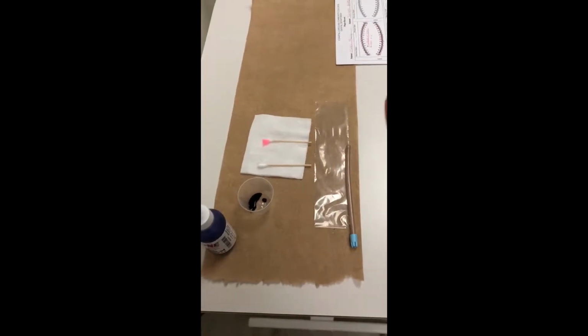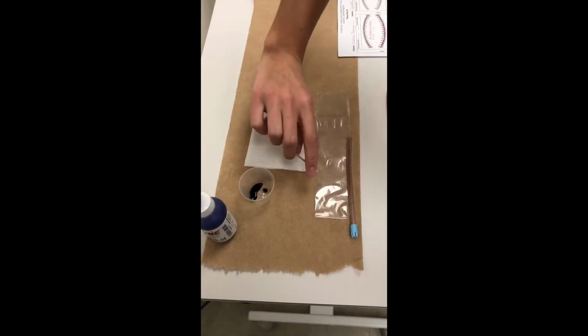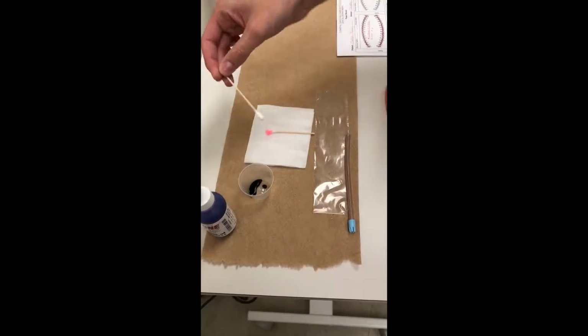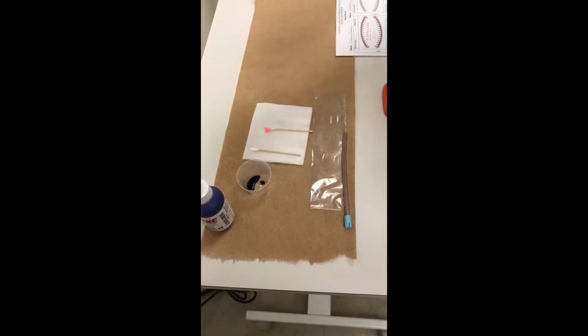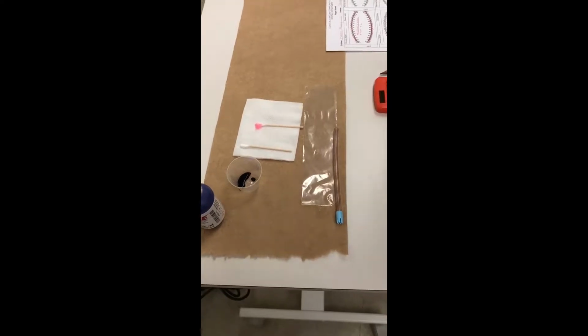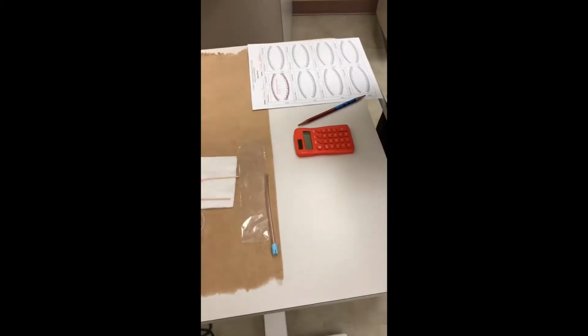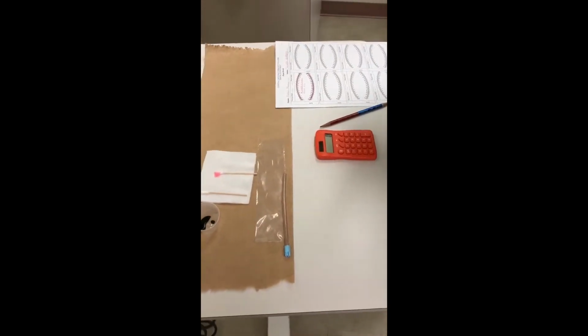One cotton tip applicator is used to rub the disclosing solution on your patient's teeth. So you would just dip it in there and then rub it on your patient's teeth. And then this is just a lip lubricant, so the disclosing solution doesn't stain your patient's lips. And then, of course, just always some gauze in case the water gets somewhere or something like that.